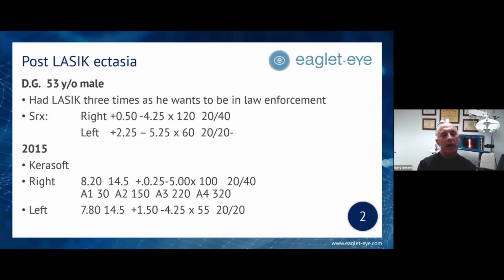So I had fit him in Kerasoft lenses. We're limited, a lot of law enforcement is having soft lenses and not a rigid lens of any kind. Even a Synergeyes or hybrid's not going to fly. So we fit him with that, and the right eye was a real struggle. And again, I didn't have eaglet at the time. We had to go to a quadrant specific Kerasoft soft lens, and we still could only get about 20/40, but we could get something to sit on his eye. The left eye was a lot easier to get to 20/20, but it was very difficult. But that's all we could do for him.